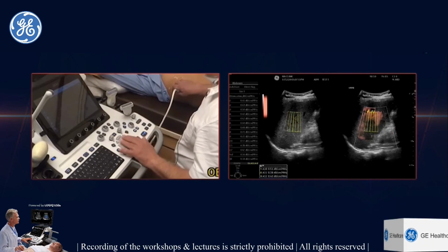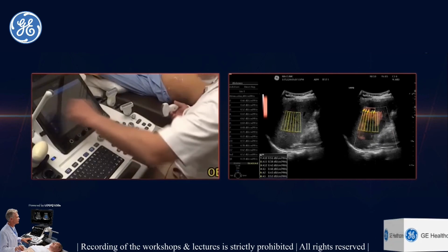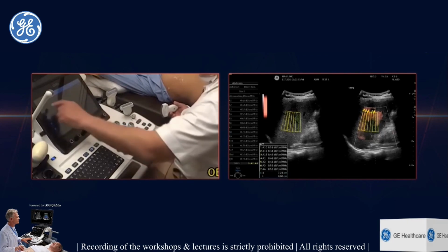And let's then take some extreme values. And then let's look at the work list.